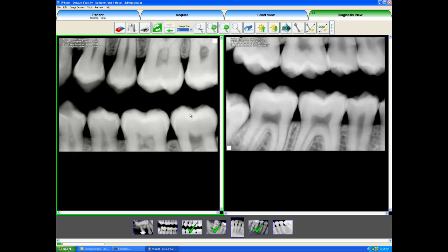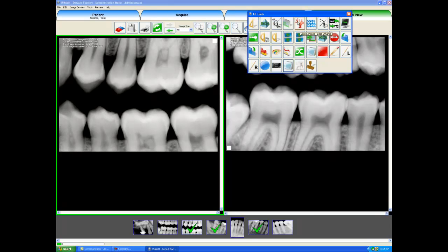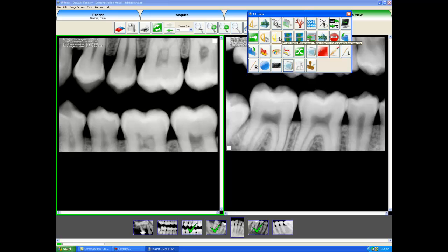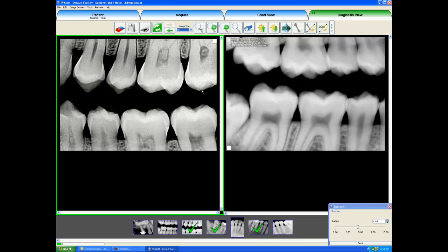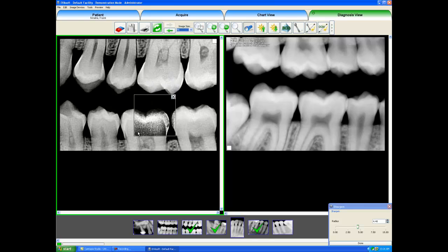Now another thing that you can do with Evasoft is we have our main tools up here, but we have many more. The wrench icon is the view all tools icon. When I click on that, many more tools will pop up. We can use different imaging filters and take measurements by clicking the physical image measurement button. Here I will click on the sharpen filter, and it automatically sharpens this x-ray — now we can see the decay really start to show up. But now watch this: I will click on the caries spotlight again over the sharpened image, and we can see that decay really pops out. It becomes quite visible, quite evident.